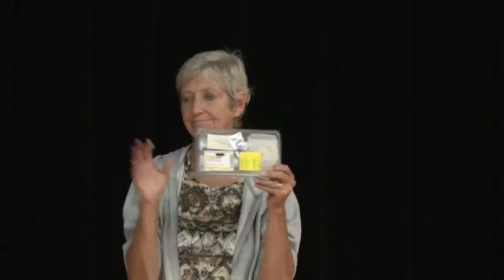The outside of the box will tell you when you're supposed to administer this Diastat. In most instances, it is to be administered after a seizure has lasted 5 minutes. But we do have some students in our district whose seizure history tells us that we don't need to wait, because we know their seizure is going to last 5 minutes. We're not going to wait. We're going to give it immediately upon the onset of the seizure, or we're going to give it 1 minute after the seizure has started. So it's important you know what the time frame is that's designated when you're going to give this medication. And it's going to be on the outside of the box.